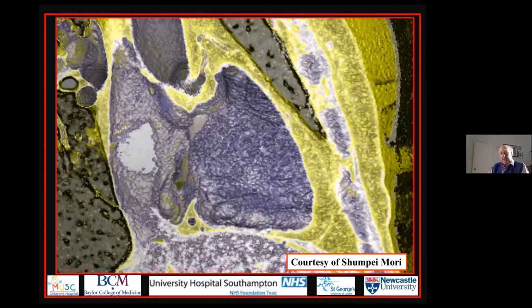Now, I know you also do the same thing in Leicester, so you're going to be very familiar with the sort of pictures I'm going to show you and with what you can achieve using computed tomography, because it's now my belief that you can see the anatomy with just as much detail using these three-dimensional data sets as I can when I have the heart in my hands.